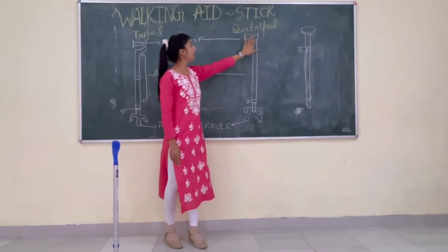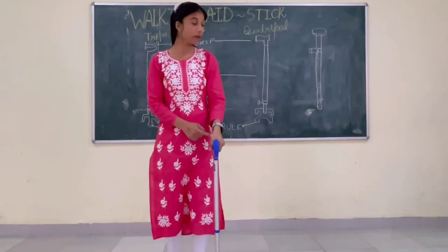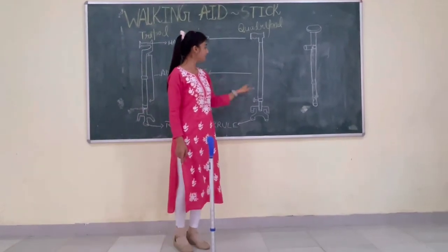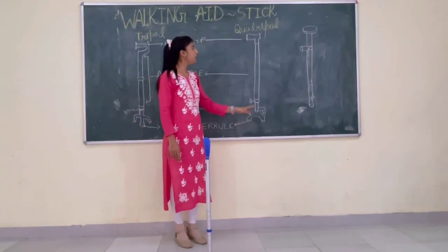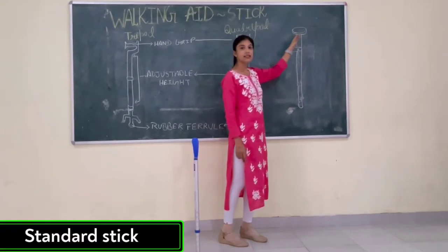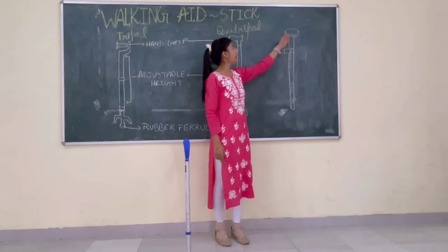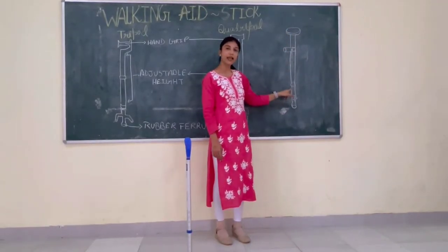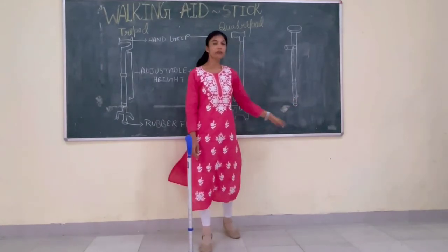The hand grip is where we can take support. The other part is the adjustable height. And the last one is the rubber ferrule. Now the next one is the standard stick, because it has only a single stand or single base of support. Its parts are the hand grip, adjustable length, and the rubber ferrule at the base.